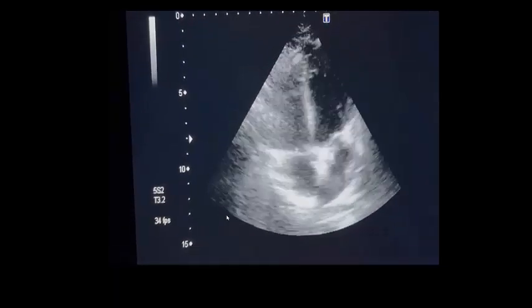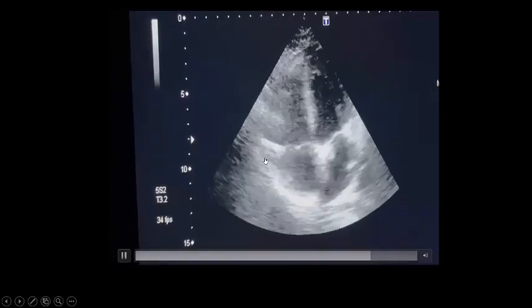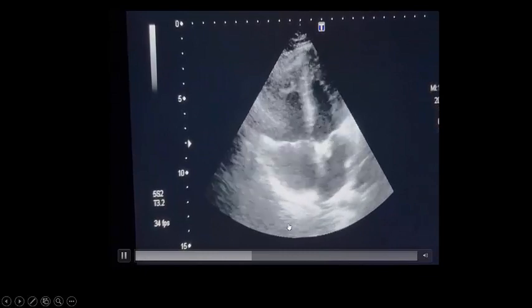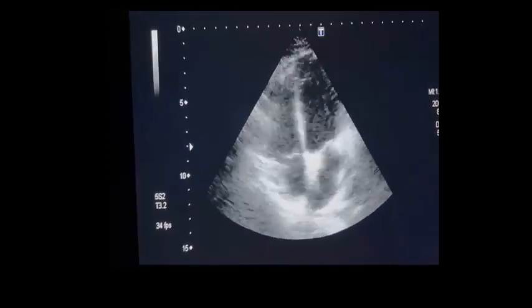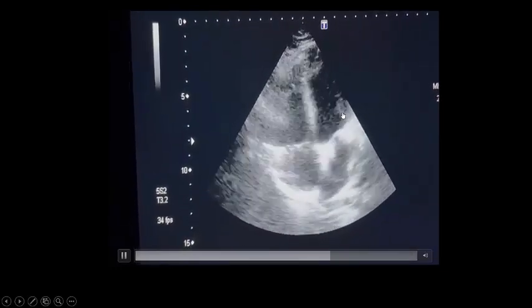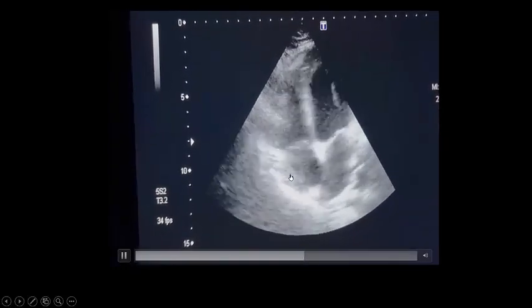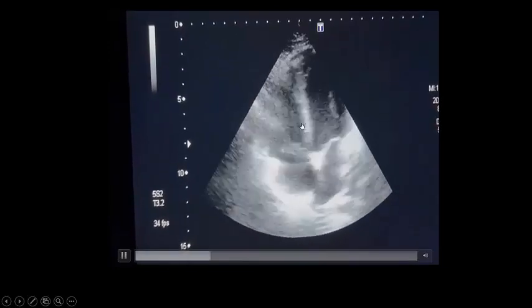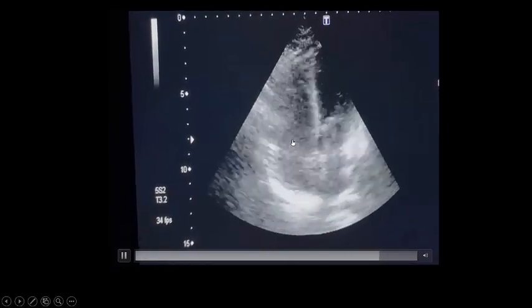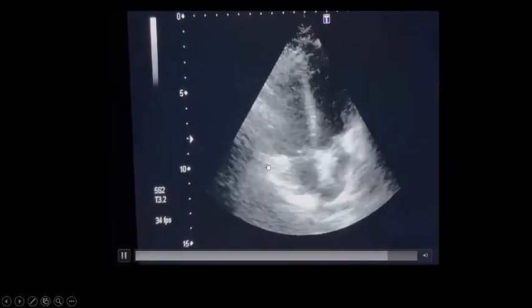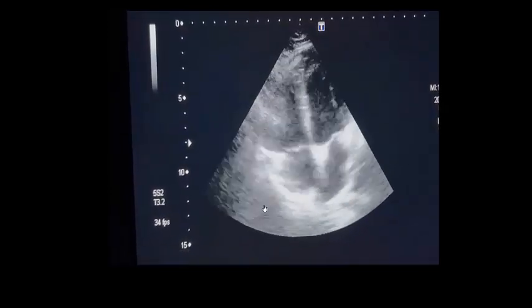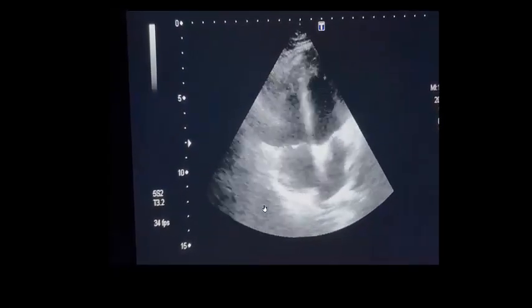The four-chamber view shows the left atrium, left ventricle, right atrium, and right ventricle, along with the interventricular and interatrial septum. As you see here, this patient in complete acute respiratory failure has right side dilatation compressing the left side. You would expect the right ventricle to be 60% of the volume of the left ventricle, but here the right ventricle is larger than the left ventricle in diameter and size, and the right atrium is also larger than the left ventricle — meaning the right side is truly dilated. This patient has dilated right side and acute respiratory failure.